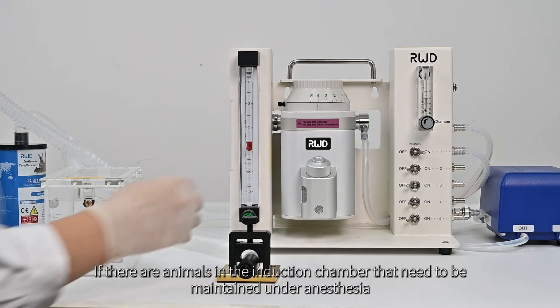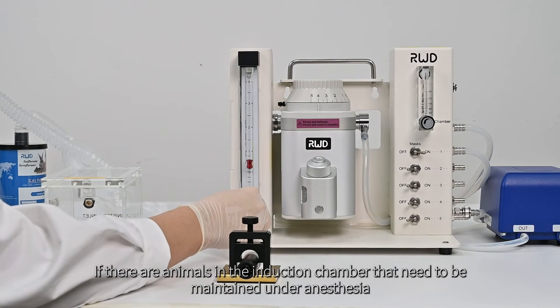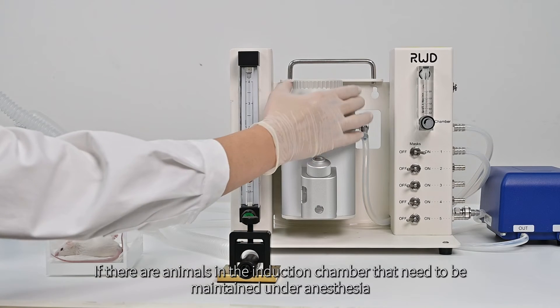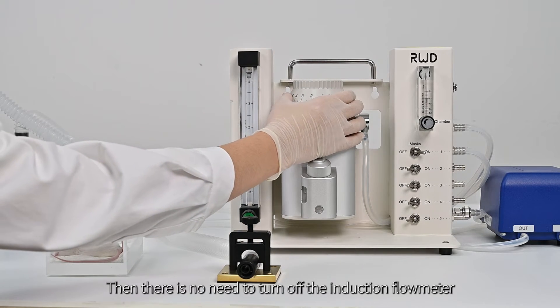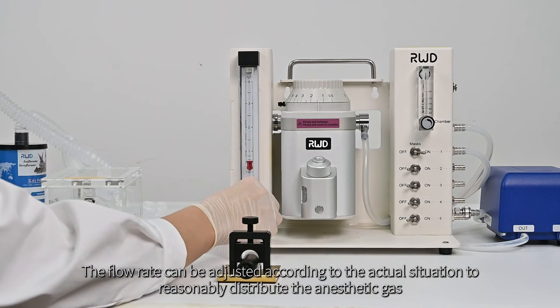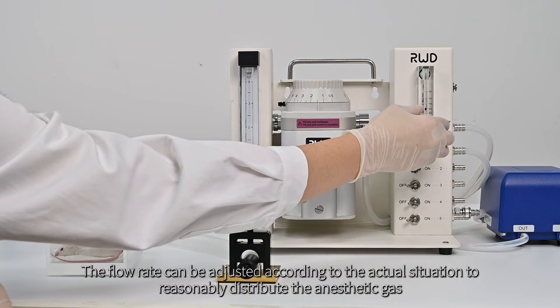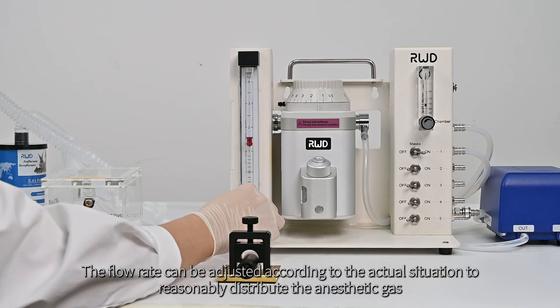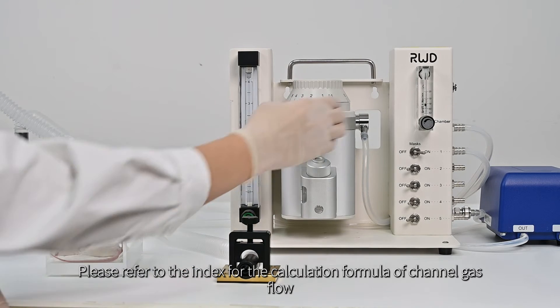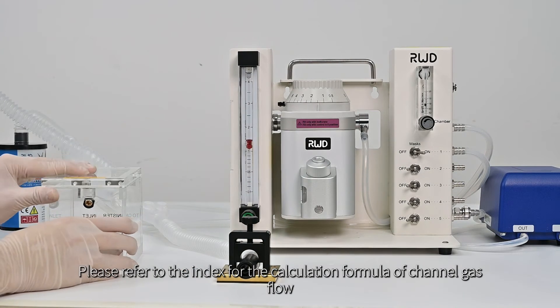If there are animals in the induction chamber that need to be maintained under anesthesia, then there is no need to turn off the induction flow meter. The flow rate can be adjusted according to the actual situation to reasonably distribute the anesthetic gas. Please refer to the index for the calculation formula of channel gas flow.